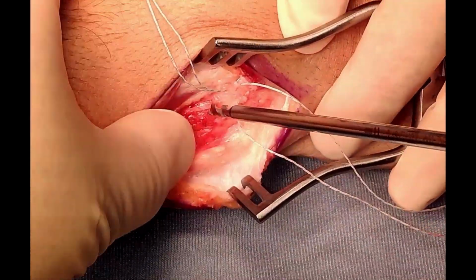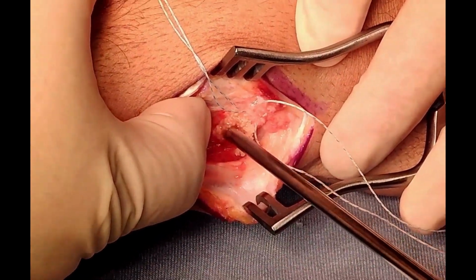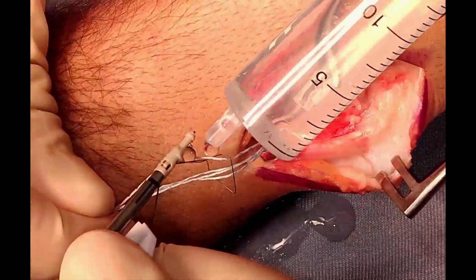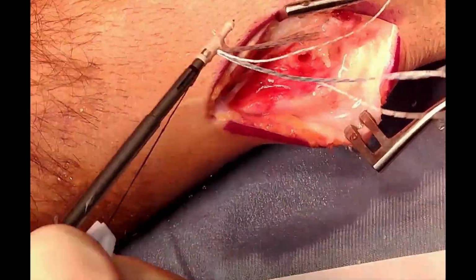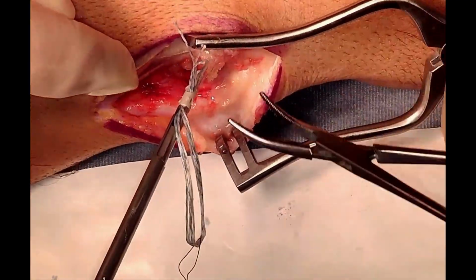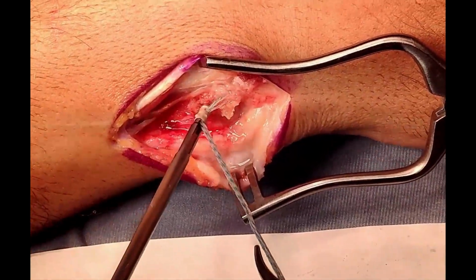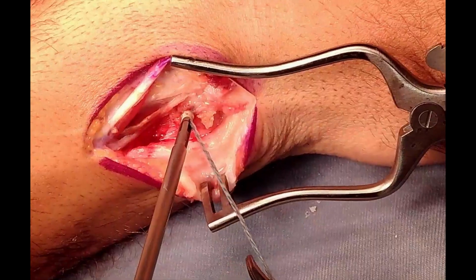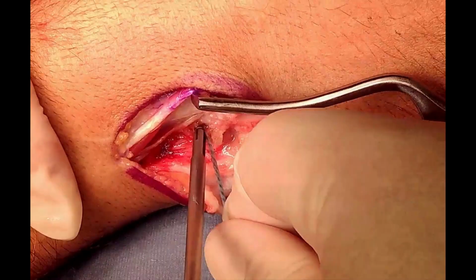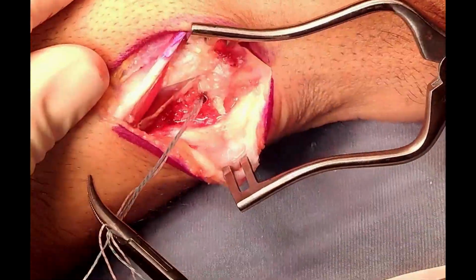Now we do drilling of the neck of the ulna. This is a Conmed knotless anchor. Now we will put all of the strands inside the anchor, and then we will reattach it to the neck of the ulna and screw it inside. This will reconstitute the dorsal radio-ulnar ligament.